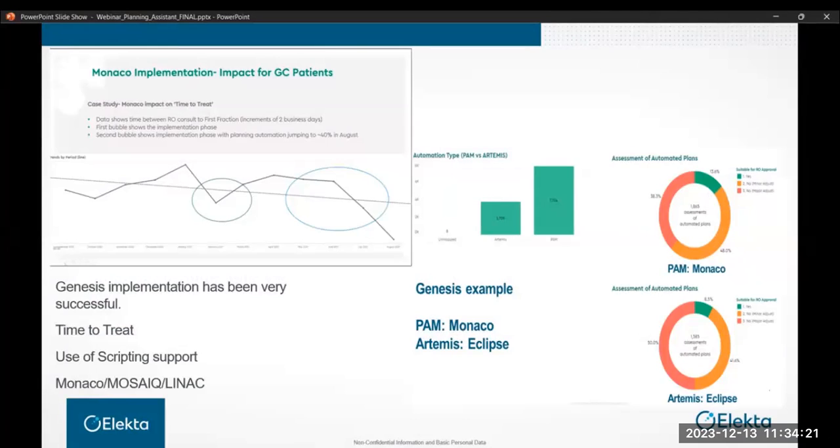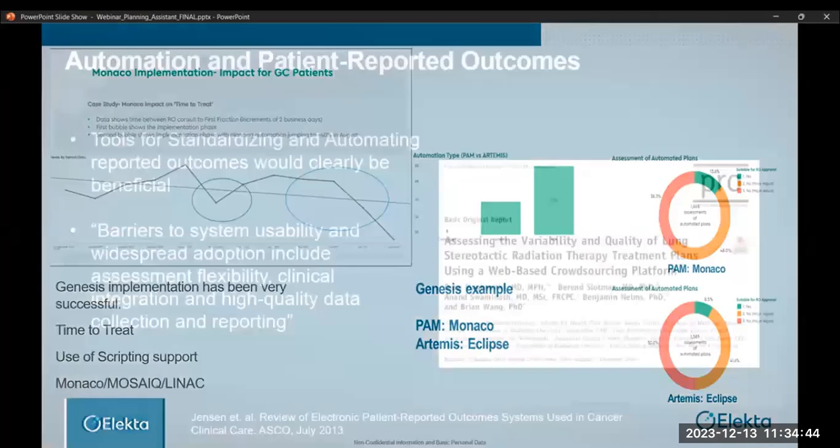And then about 48% of them are requiring minor editing, which is usually a rescale. So that means that, again, not only are you creating a huge amount of automation, but then you can really look at moving the actual radiotherapy planning to more of a reviewing process rather than being something that you have to begin from scratch every single time.